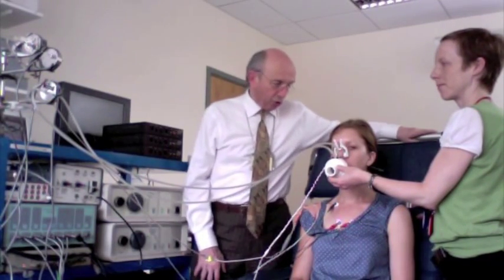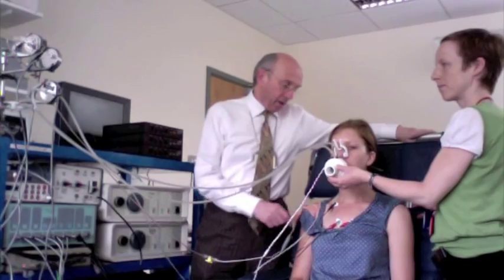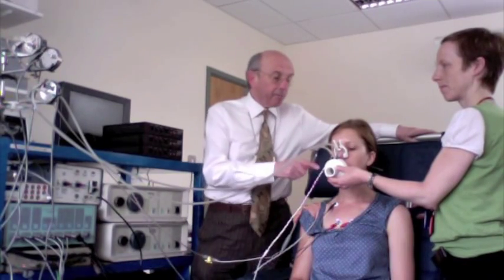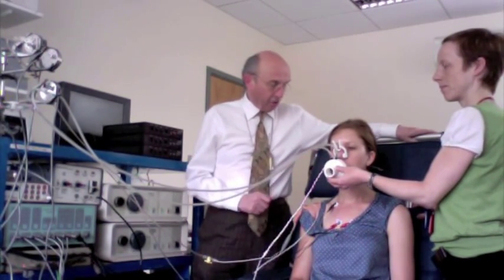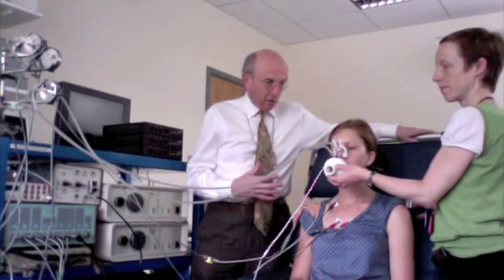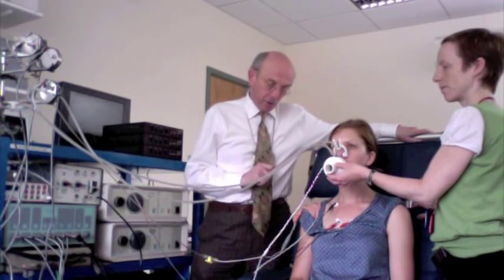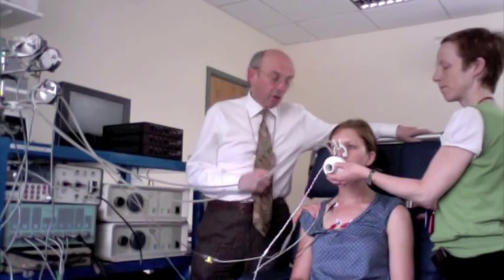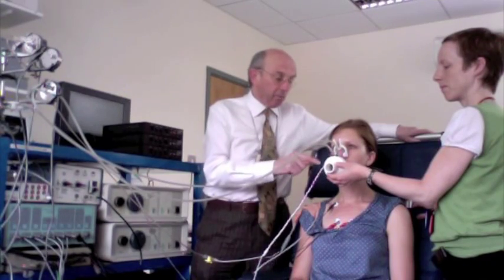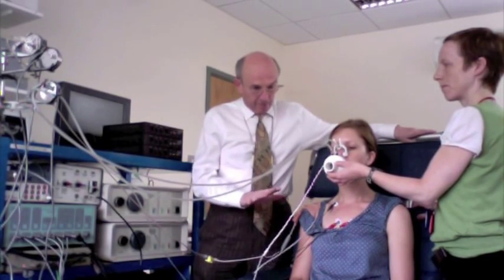What we're going to do this morning is look at the EMG of the parasternal muscles at the top of the chest and also the EMG of the diaphragm, which we're going to record from this esophageal EMG catheter. We're going to look at that measure of neural respiratory drive during quiet breathing, and we're also going to measure the pressures — this catheter has esophageal and gastric pressure measurement capability, and we can measure the transdiaphragmatic pressure.